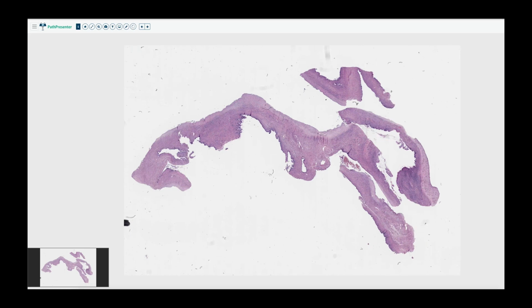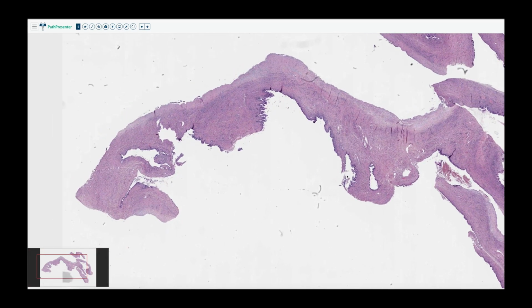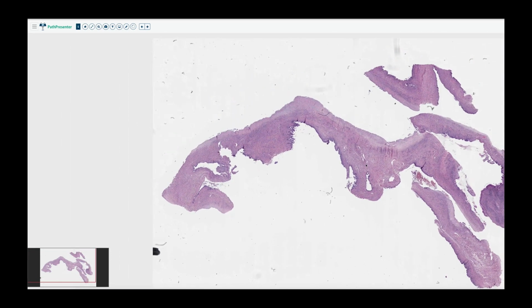Okay, now we're going to move on to mucinous tumors. So this is a mucinous cystadenofibroma. And once again, just like the serous case, you start off at low power. You always want to look and see, what am I dealing with? Is this actual ovary? Is this probably a mass?